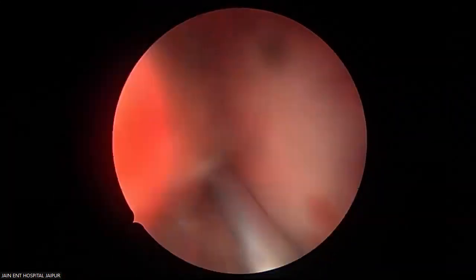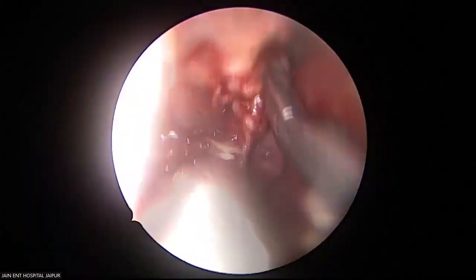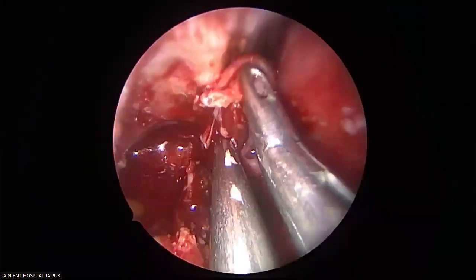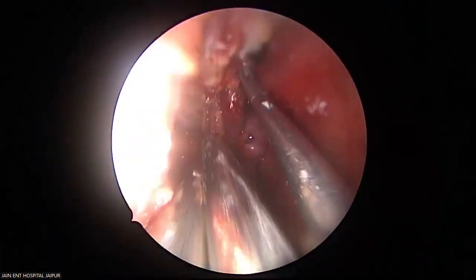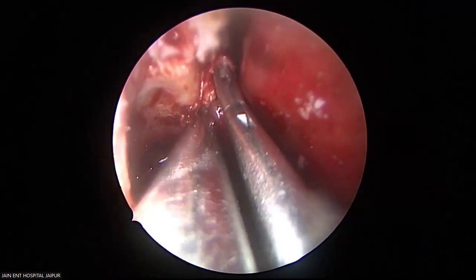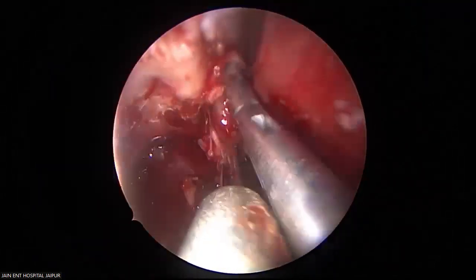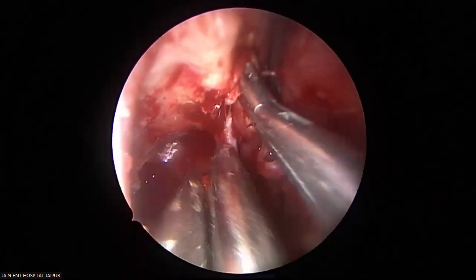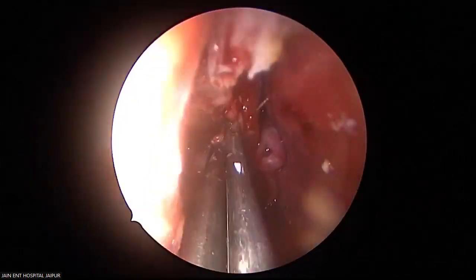Debrider. See now, I'm just flushing it from all around. See the bone all around, the duct being completely skeletonized. Drill.